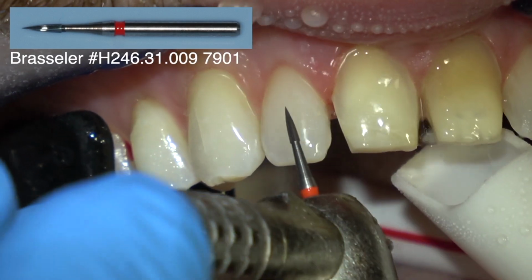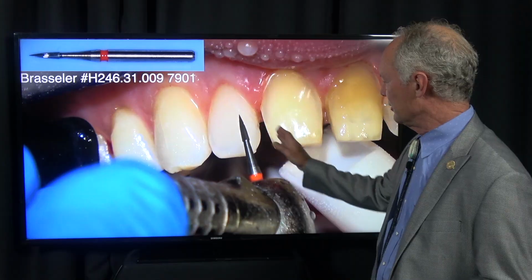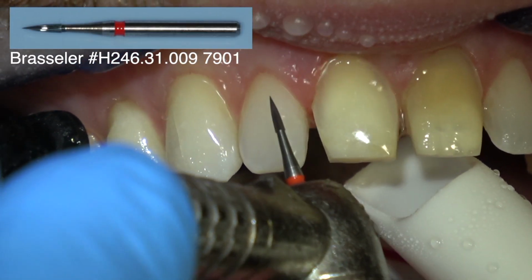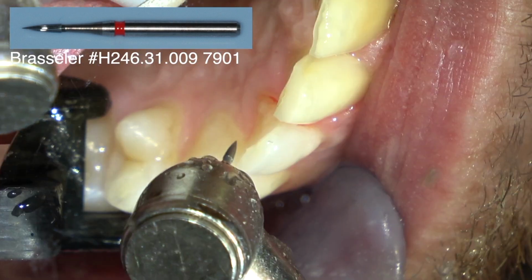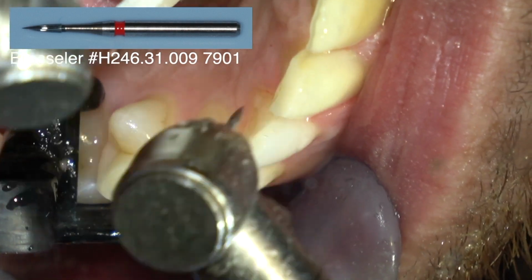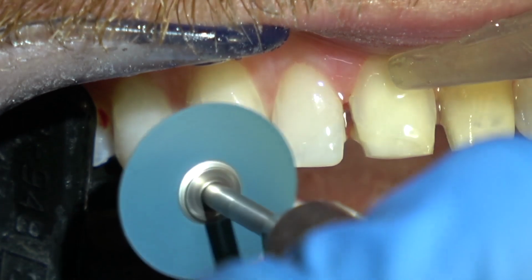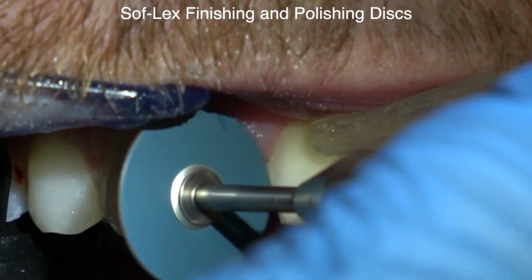Then I'm going to cure this for about 20 seconds, and I'm going to use either a 12 fluted or a 30 fluted carbide burr to initially contour the composite and move the burr in the polishing direction. You know, there's one direction you move a handpiece or a burr and it cuts, and you move the other way and it polishes. So you want to move it in the polishing direction. Just smooth it, very light touch, a lot of water.